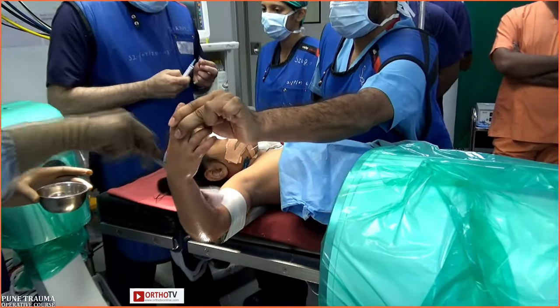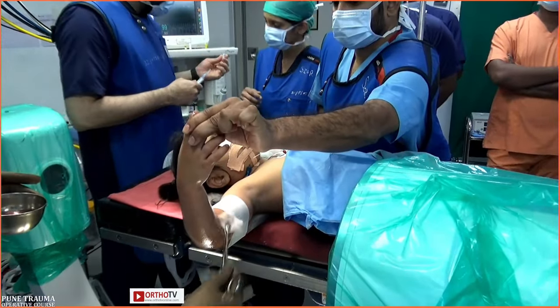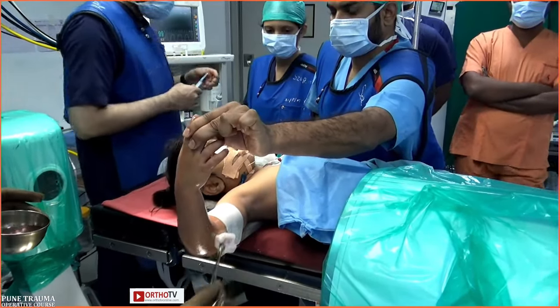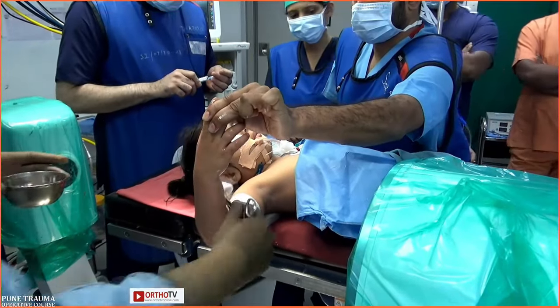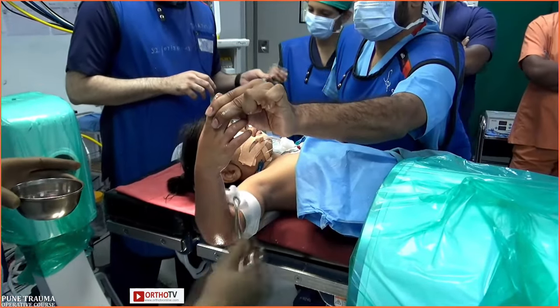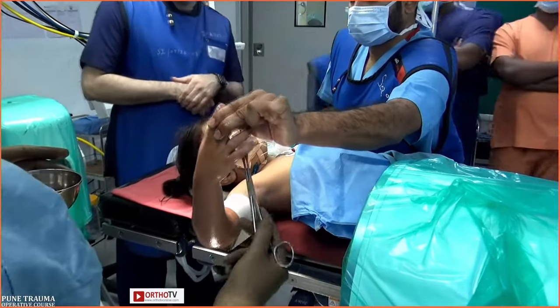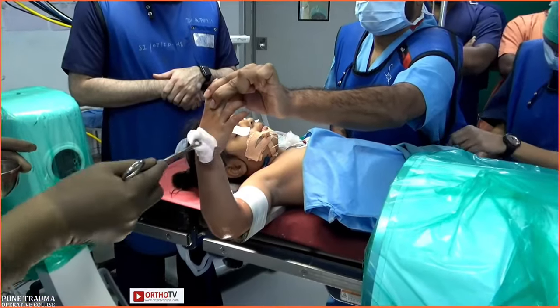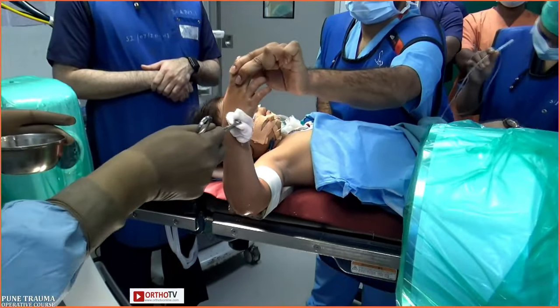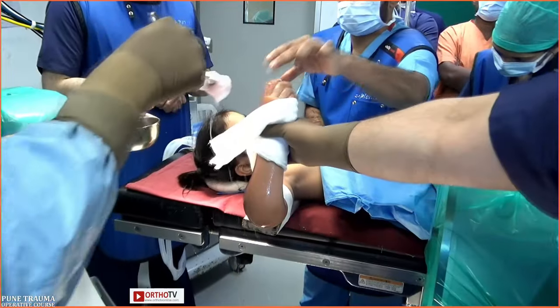The preparation with skin prep goes all around, including the hand. We'll drape it with an O drape. I have a special pediatric O drape which I'll show you. This was just to demonstrate, before I start surgery, since yesterday we have been hearing you should get the reduction before implant. So that was a sample reduction. I always check whether I am able to get the reduction.